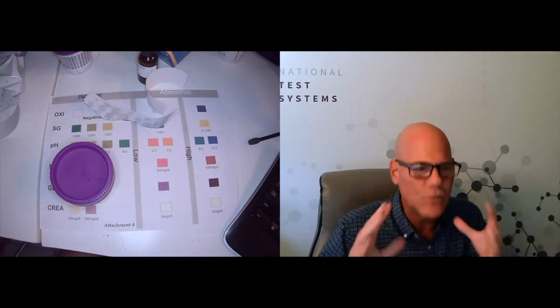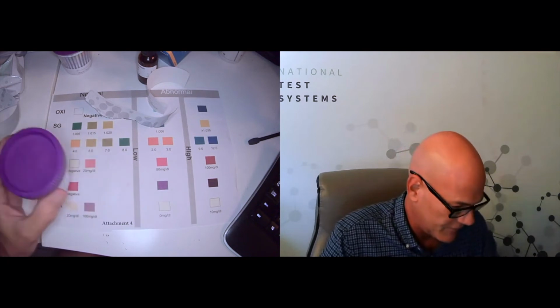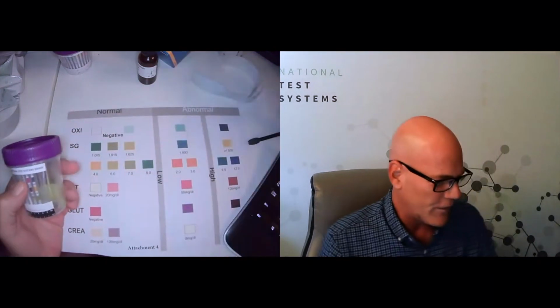Again, please wait at least the 1 full minute when you're doing this in your office. I'm only cheating here for the sake of saving you guys some time so you don't have to hit fast forward on me. All right, so here we're going to start again with the nitrites.